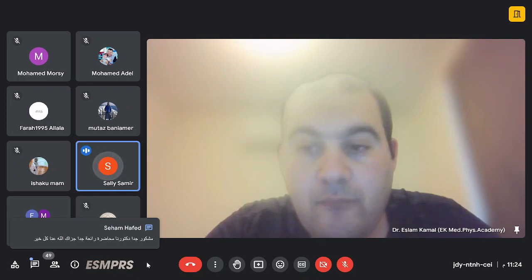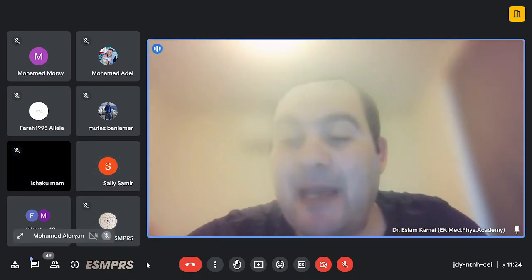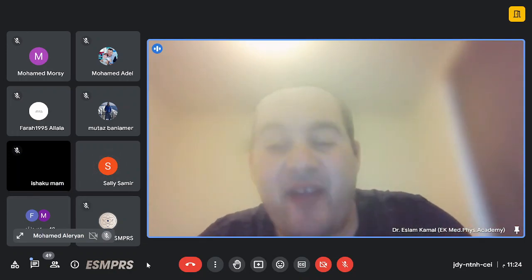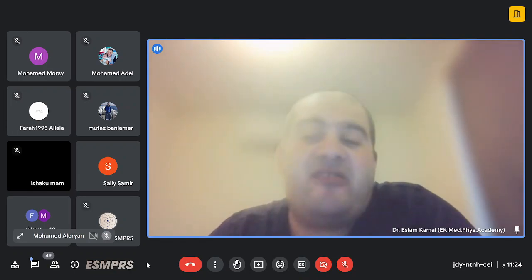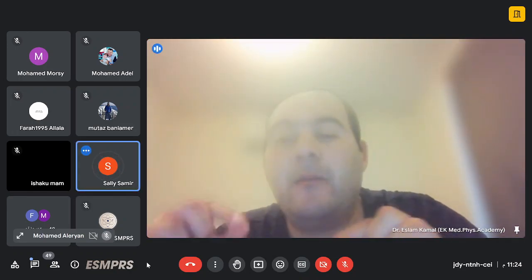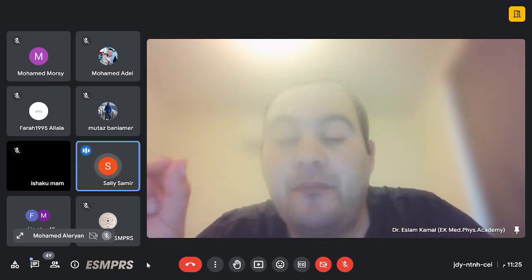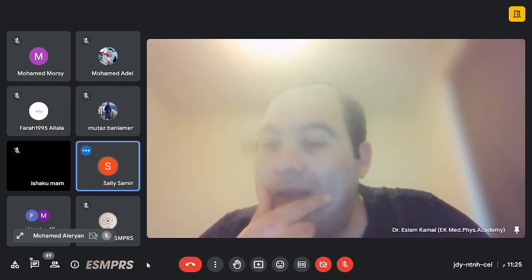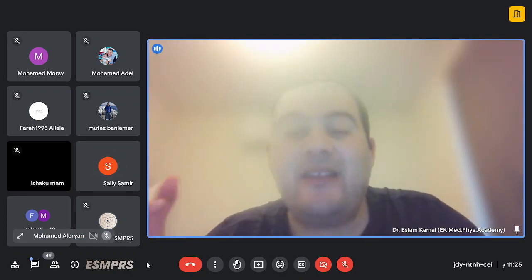دي عاوزة تيست. هي دي بقى البوينت، لأن الصبغة لو هو ليه same effect مع الـ T1 مع الجادولينيوم، يبقى في الحالة دي الـ T1 هو الستاندر بالنسبة لك. فده هيديك more bright signal أو more differentiation، وده يتطلب طبعاً هوموجينيتي عالي جداً، صح؟ طبعاً، كل ما كان الهوموجينيوس ماجنتيك فيلد عالي يديك more differentiation.